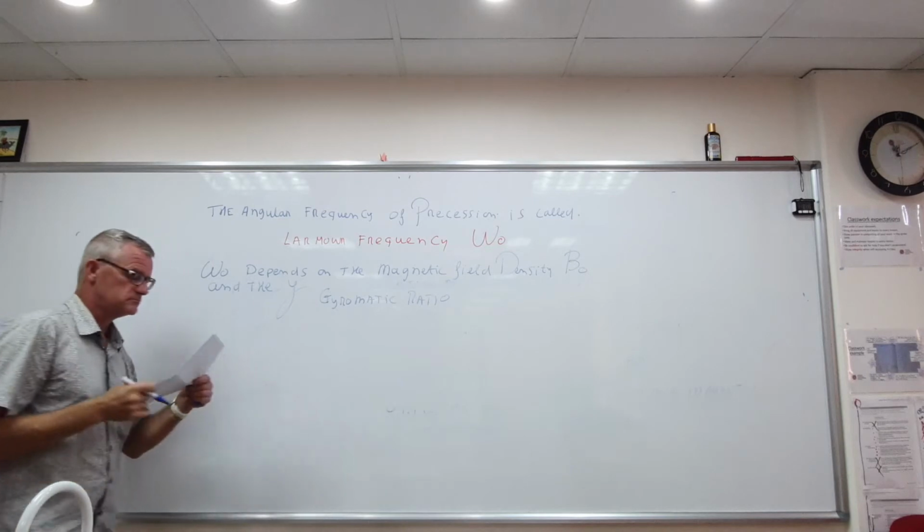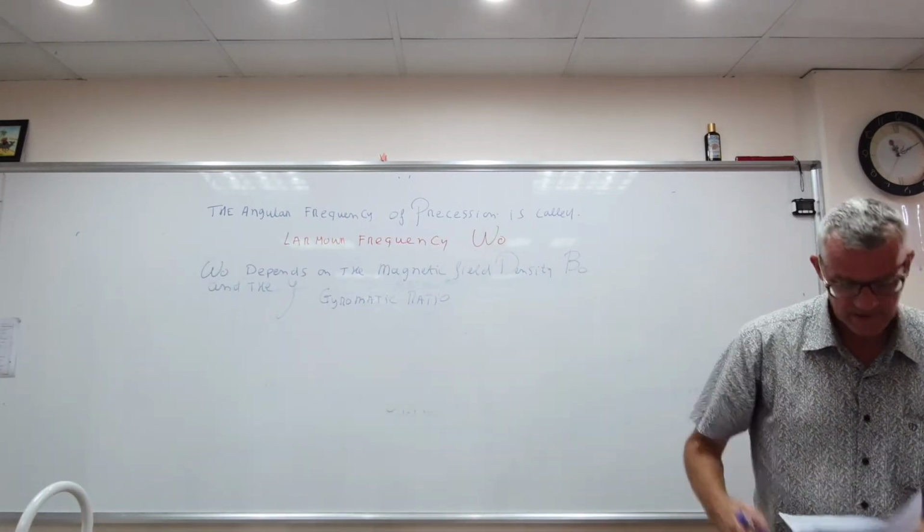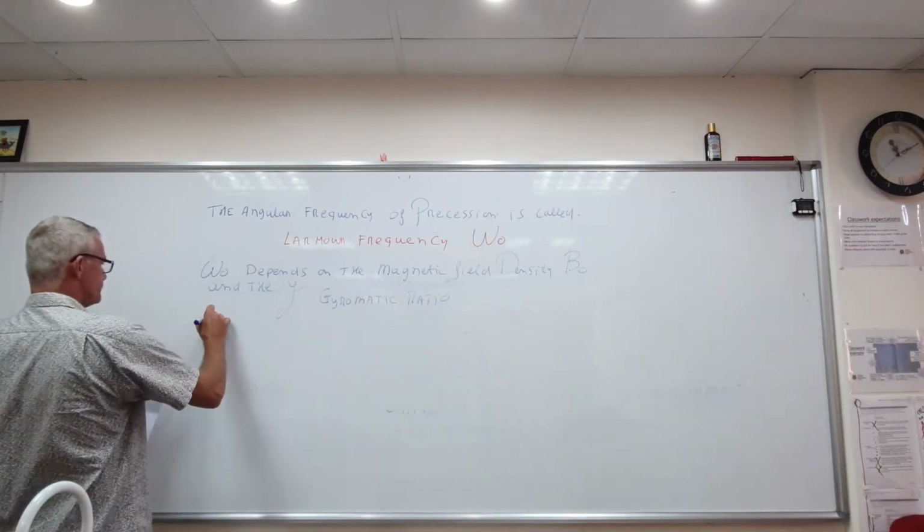Okay? So the stronger the magnetic field, the faster the protons will spin.